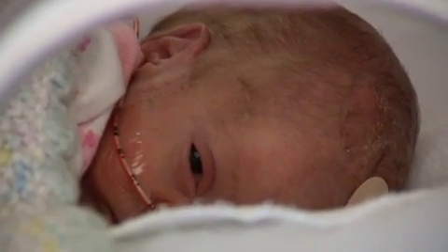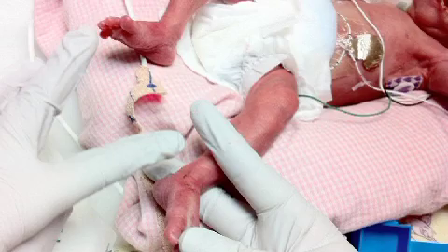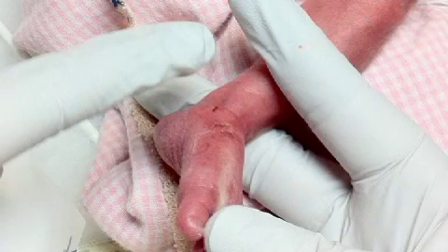Many victims are preemies, like Iris, who rely on the tape to keep them attached to critical equipment. She had tubes and wires coming out of all different places. The problem is that neonates have very fragile skin, and all of these tapes have been tailored for adult skin. Neonatal nurse Kareen Pryor says it's something that we deal with every day at work.